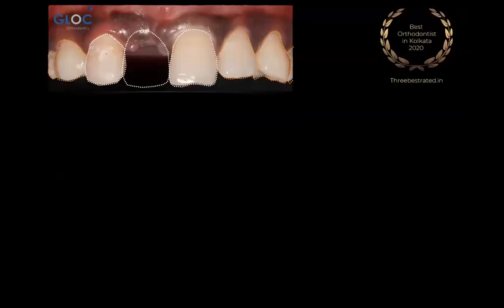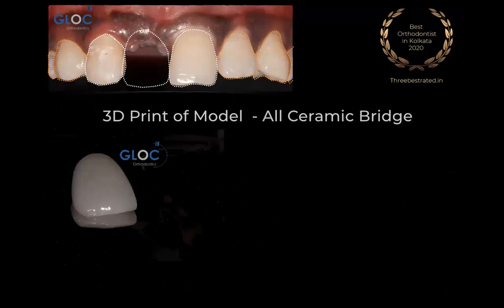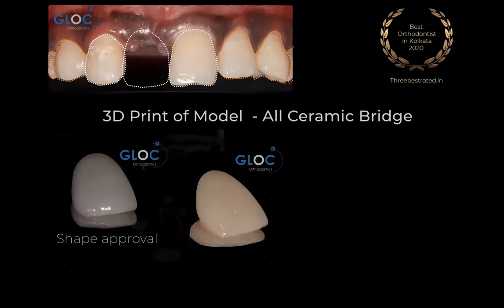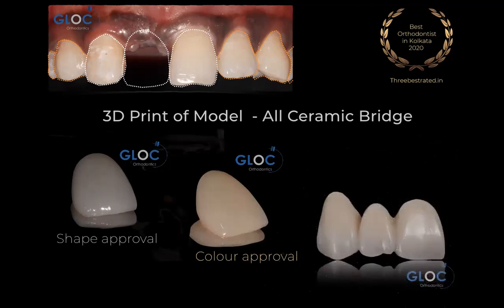Once the analysis is done and the cutting of the abutment teeth or crowns is done, we take a 3D print of the model and then construct an all ceramic bridge. Now, first we get the shape approval done from the patient. And once the shape approval is done, we go ahead and do the color approval. Once the color approval has been finalized by the patient, then we construct the dental bridge.